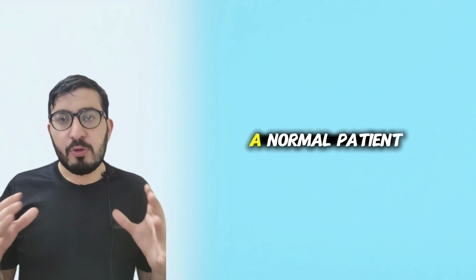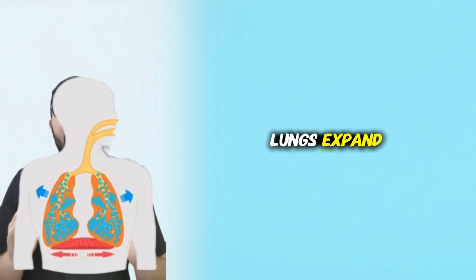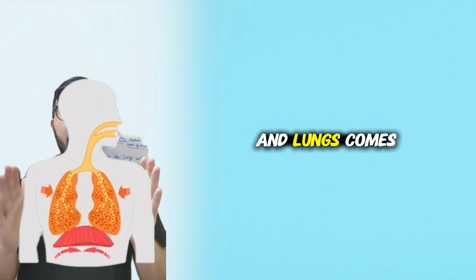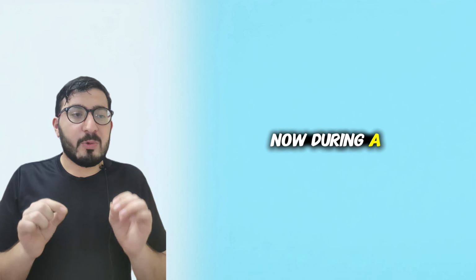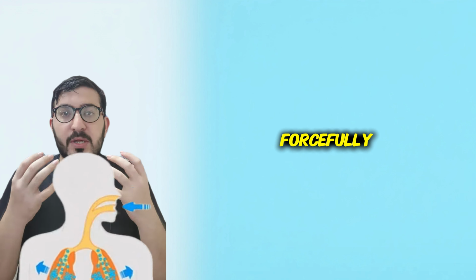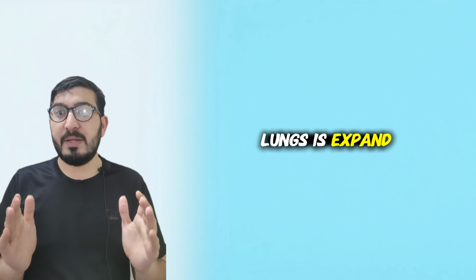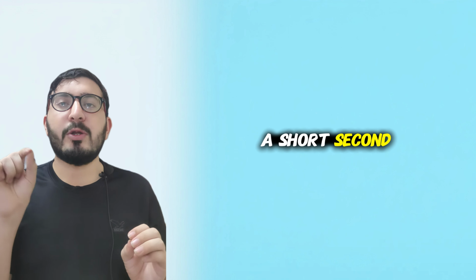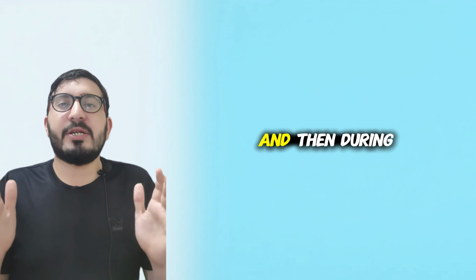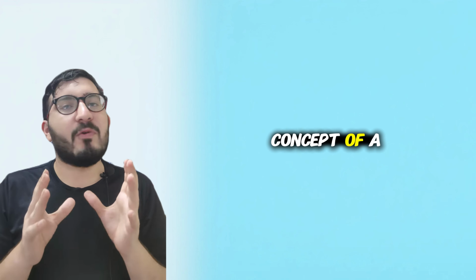The basic idea of how a ventilator actually works: in a normal case, a normal person inhales air through the mouth, our lungs expand, and then we exhale air in the form of carbon dioxide and the lungs come back to their original position. Now, during ventilation, the patient is unable to inspire oxygen forcefully. So with the help of the machine, air goes to the lungs and they expand. Then for a short second, the ventilator stops the air. Then the lungs come back to their original position, and in this way carbon dioxide is removed. So this is all about the concept of a ventilator.